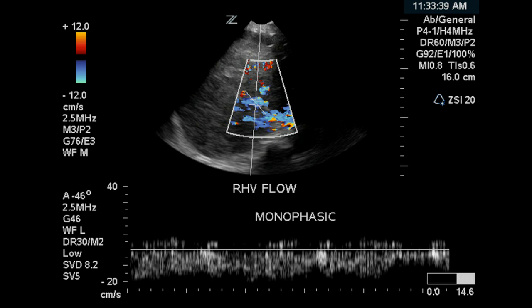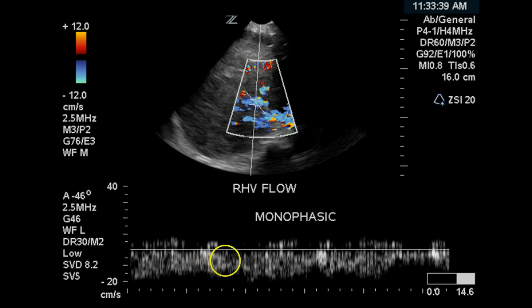This is an image of the right hepatic vein and this is abnormal flow. There is almost continuous flow here. There is no evidence of an atrial kick. There should be phasic or pulsatility flow within this vein.